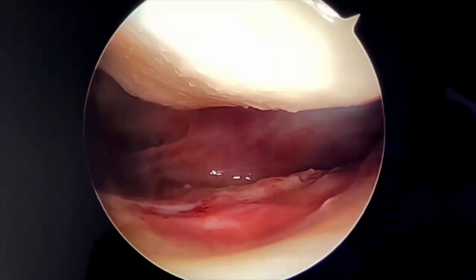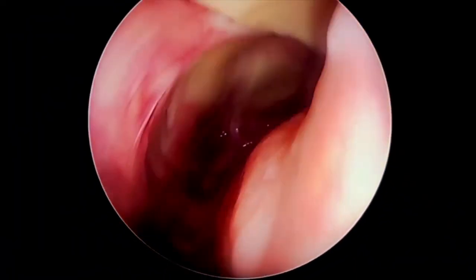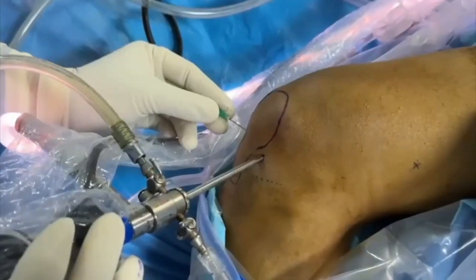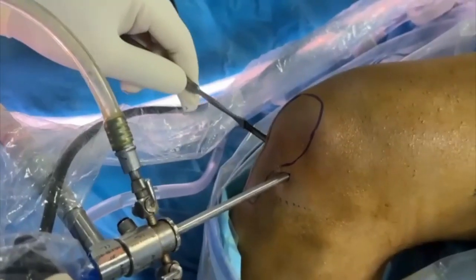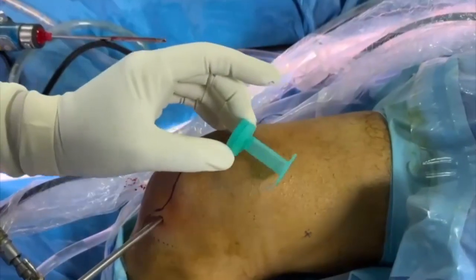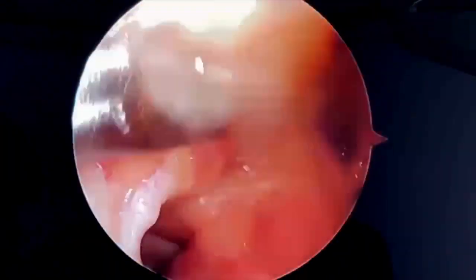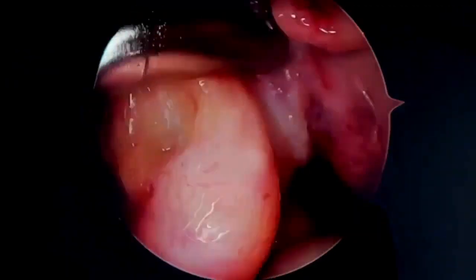During a dry diagnostic arthroscopy, the surgeon creates the position for the standard anteromedial approach under direct vision. This is first assessed with a needle and then with an 11-point scalpel, after which the skin is incised. A hemostat clamp or blunt trocar is used to remove any soft tissue and puncture the joint capsule, providing a sealing effect. This creates an anteromedial portal for the passport button cannula. If any remaining fat pad obstructs clear vision after joint insufflation, it is removed by a shaver.